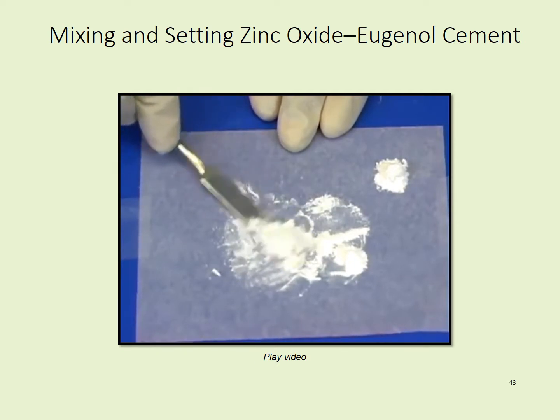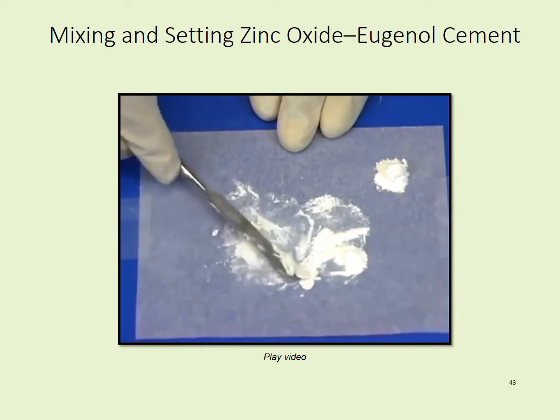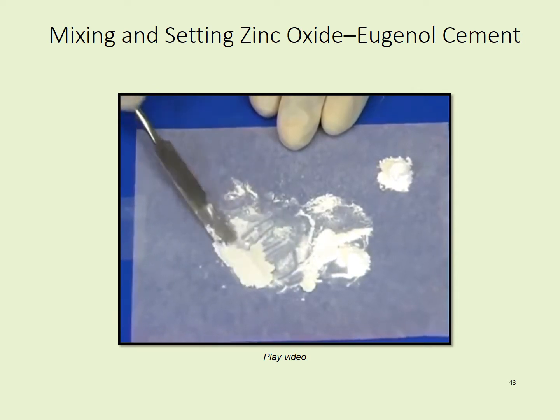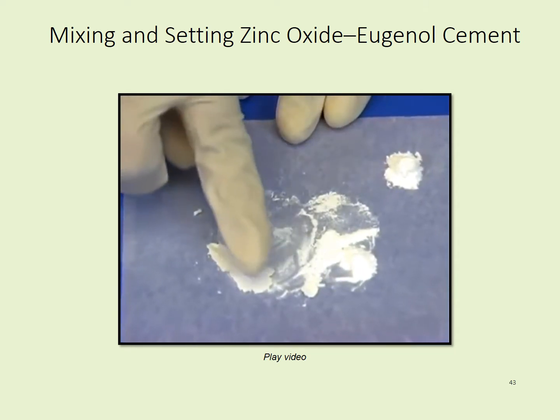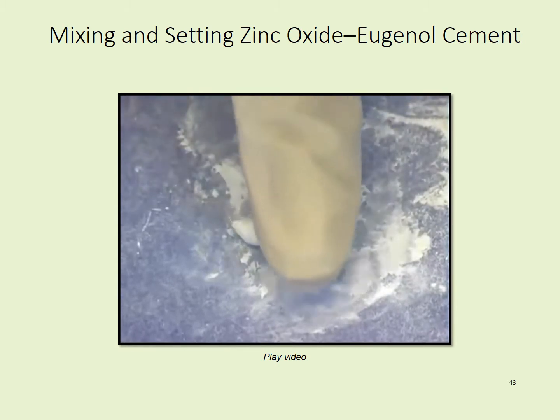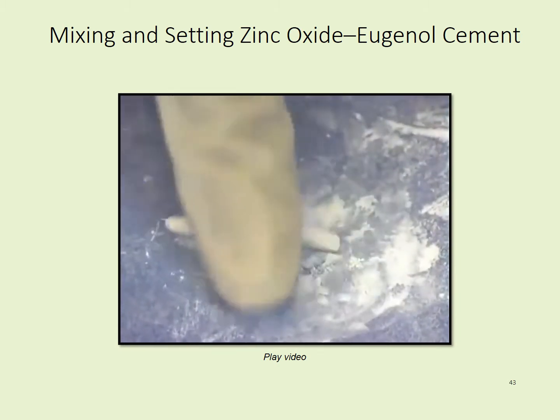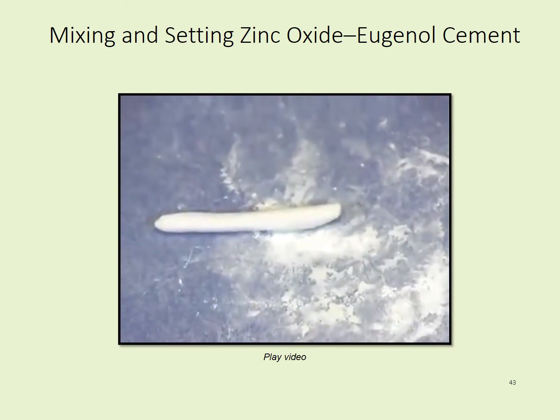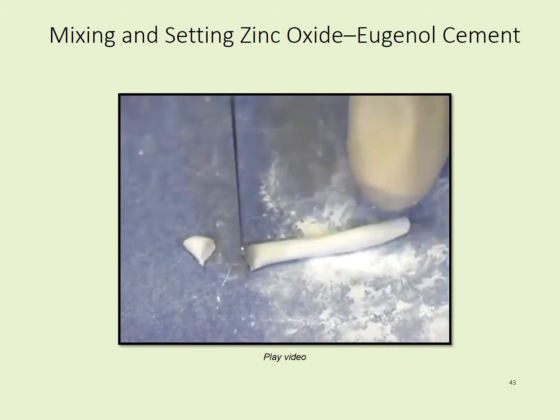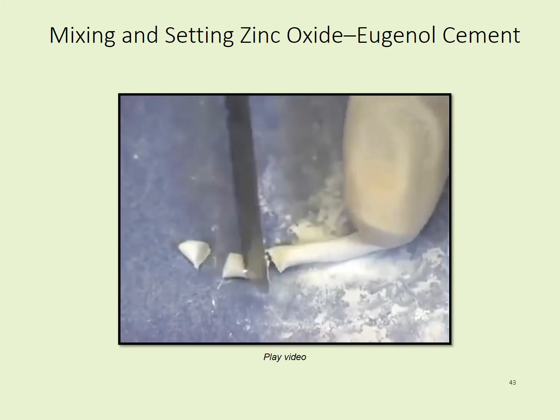The cement is the correct consistency when it can be rolled into a ball or roll. Check with your fingers that it is not tacky. Roll cement into a rope with your fingers or the spatula and break into smaller pieces. Each piece will be carried to the cavity preparation.